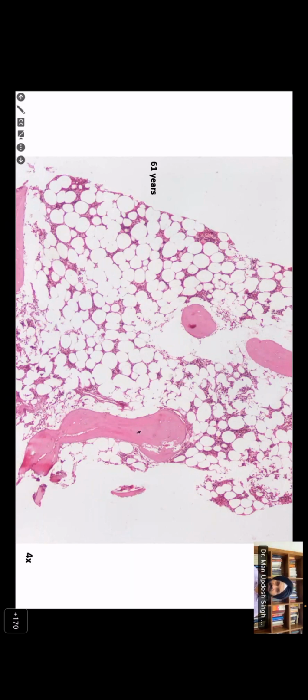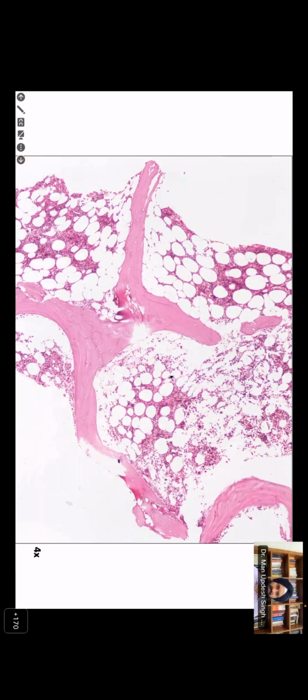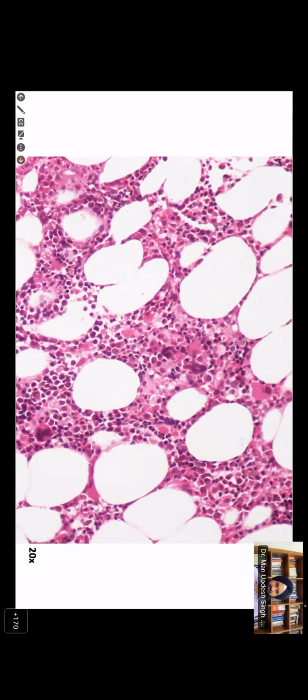Okay, mildly hypocellular definitely. Trabeculae look normal. So no aggregates of cells here. This cellularity is just okay for 61. It's definitely okay for 60 years. No problem for that. And then we go to the cellular areas. Anything here? You see megakaryocytes? Yes, sir. Probably you see the granulocytic cells, a lot of granulocytic cells, some erythroid islands, the fluffy cells, again at higher power.